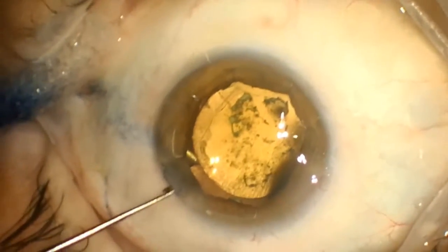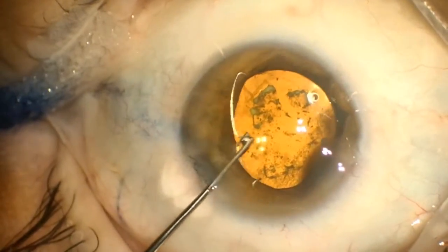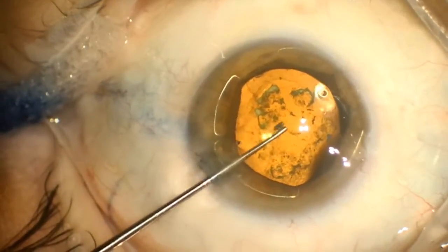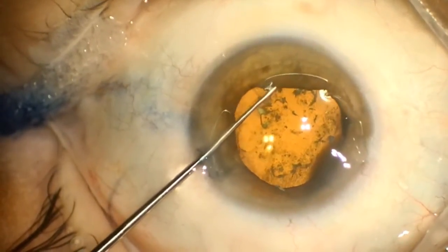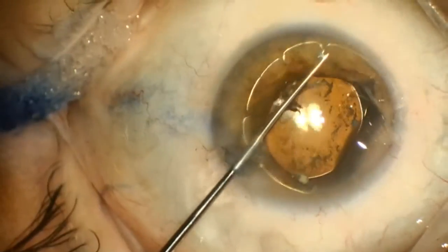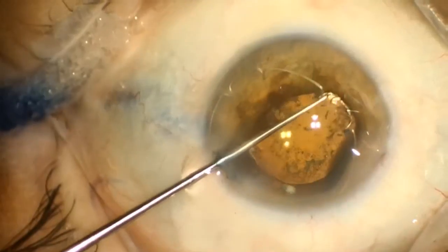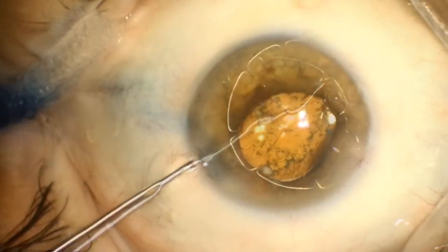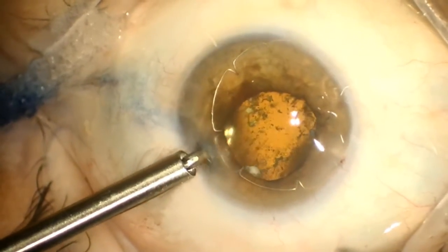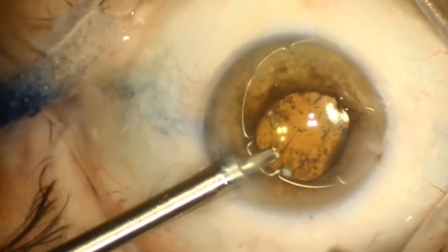As promised, this video shows one technique to remove the iris ring with the injector. The sub-incisional foot is disengaged from the iris and elevated into the mid-anterior chamber where it can be grasped by the injector. Once all four feet have been freed up from the iris, the device is positioned immediately in front of the main corneal incision where it is easily grasped by the injector.